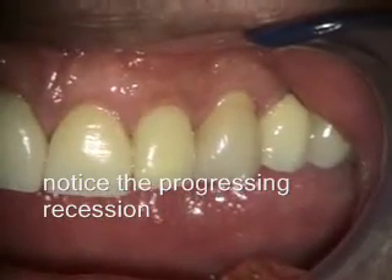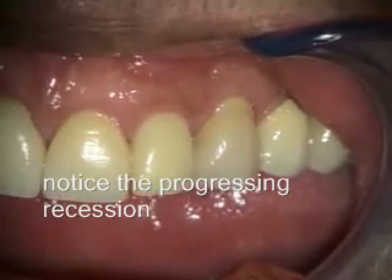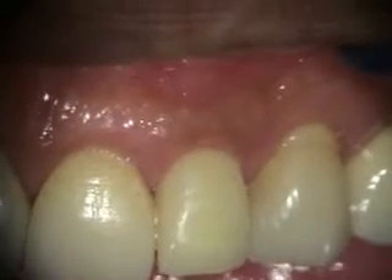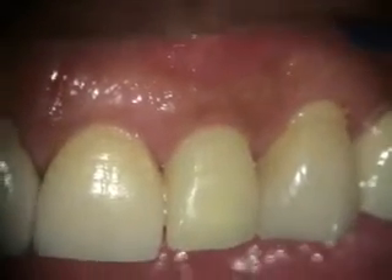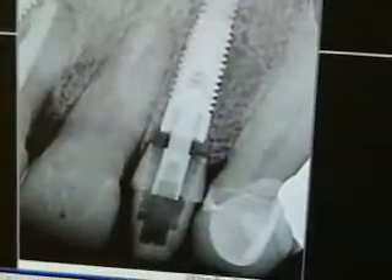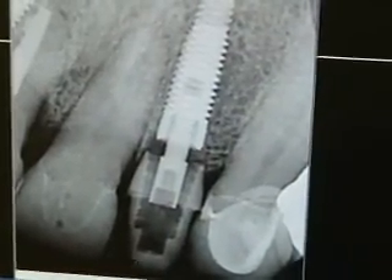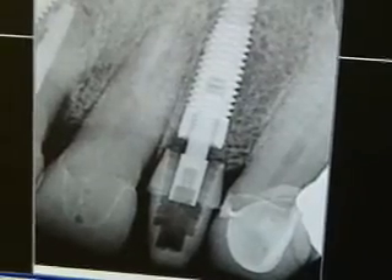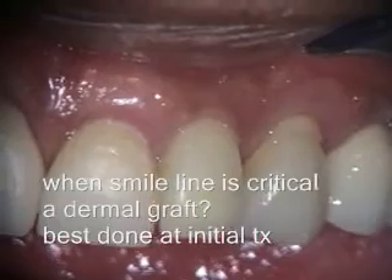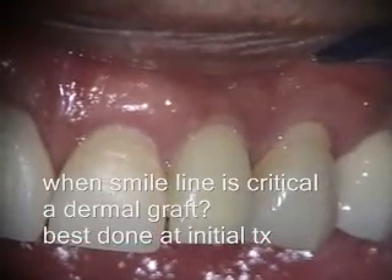This is a two-week healing of the immediate implant and provisional on number 10, and he'll be going for the final restoration next. This is a three-month healing of the immediate implant and provisional on number 10, and he'll be going for the final restoration next.